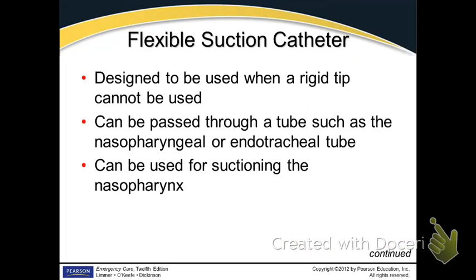Pick it up. Now, we don't put our hands in people's mouths because we end up looking like this. They bite the finger off. Then you have another airway obstruction. But you're right. If there's a big hot dog back there, I would take this suction device, go back there and get on top of it and try to pick it up. If this wouldn't do it, then I take the tubing and try to get it out with the tubing. Otherwise, I'd have to do something else to get that out.